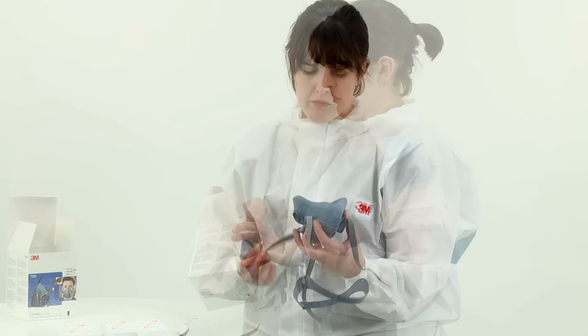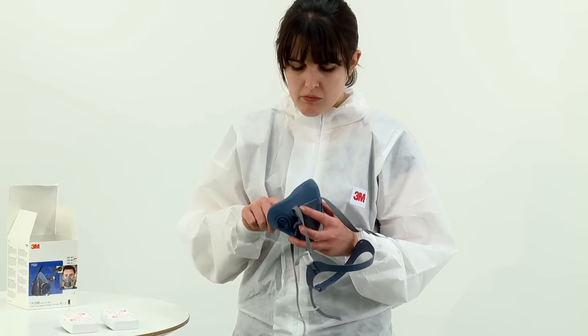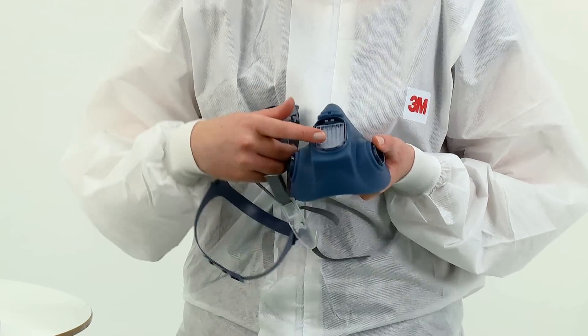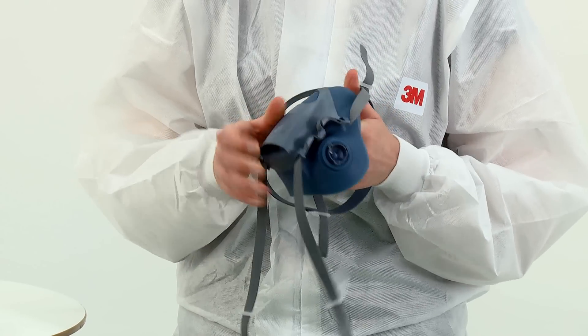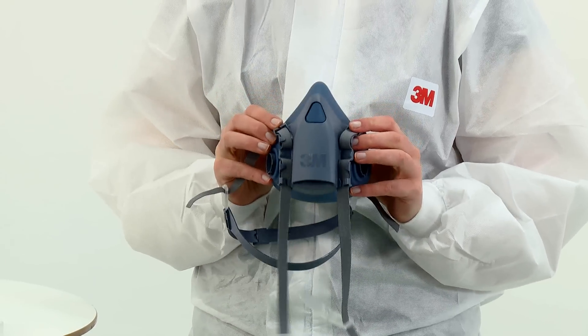To begin, remove the respirator from its box and bag and inspect the respirator and its components for damage prior to each use. Prior to fitting the respirator to your face, you should fit appropriate filters.